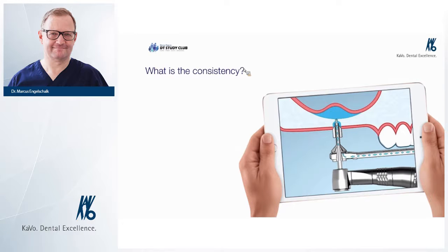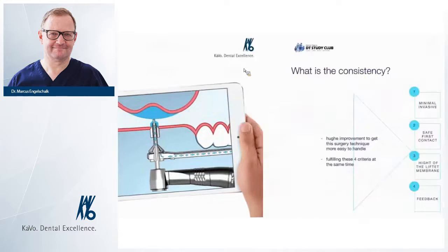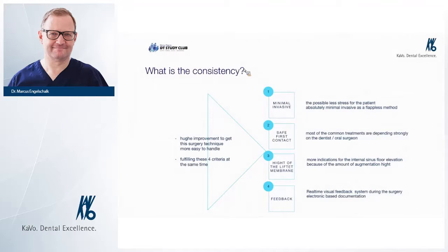Fracture of the bony sinus floor, as I mentioned already. If you fracture with the osteotomy technique the last part of the bone, then you might cut little holes into the membrane.